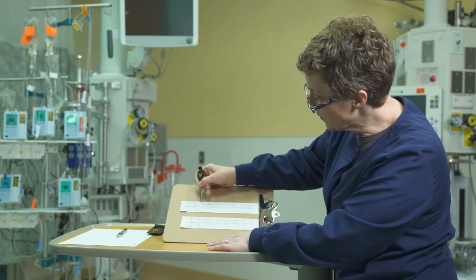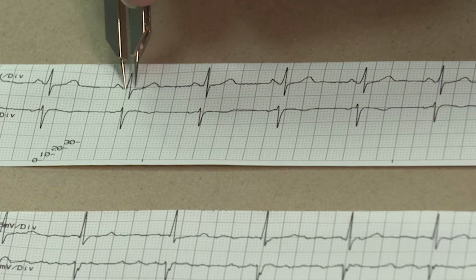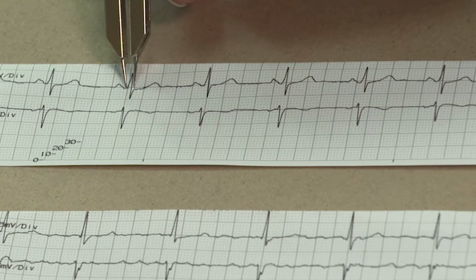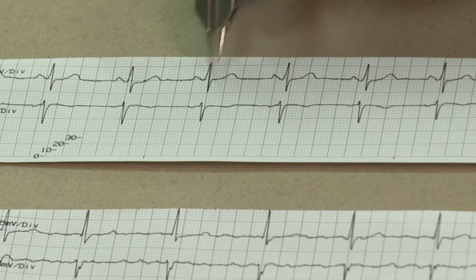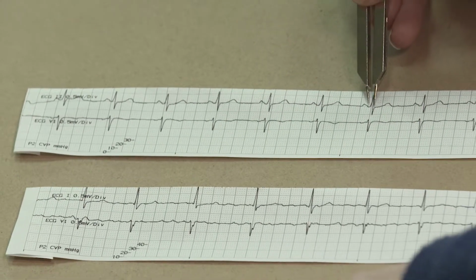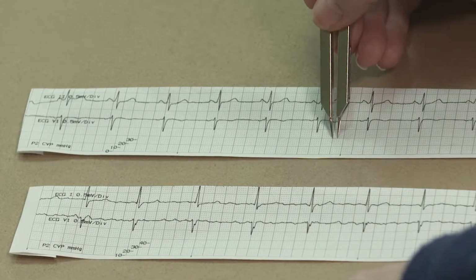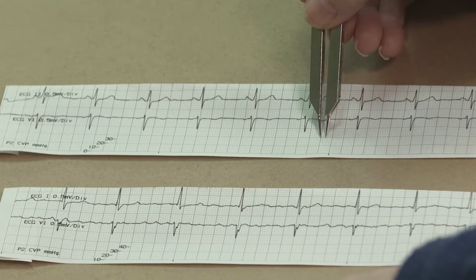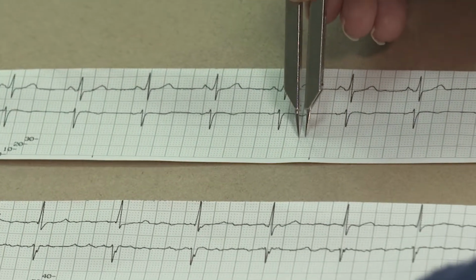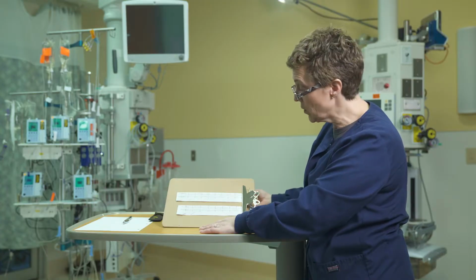My QRS interval goes from the first upward deflection to the return to baseline. And bring the calipers in like that. Again, I'm going to map it across and see that that is consistent all the way through, which it is. Again, I'm going to take it down away from the waveform to a solid line to measure. And this one is about 0.10 or 100 milliseconds. Again, it's within normal limits.